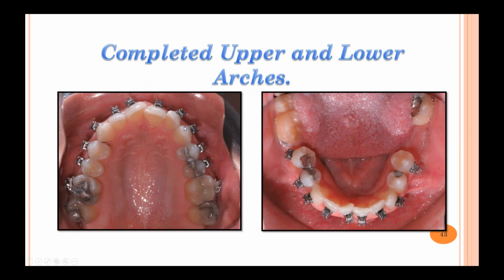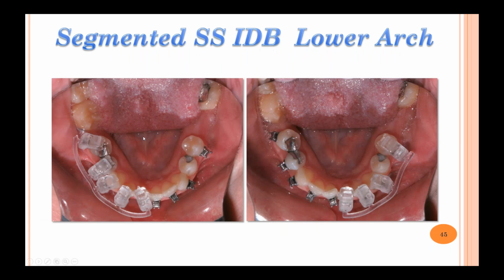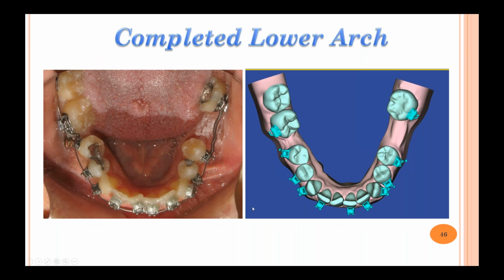And then here are photos of the completed upper and lower arches. This is just showing the digital setup with the true setup from the occlusal. And again, a blow up of the segmented trays here with the mandibular dentition. And then this was an example of the digital setup with what actually happened here.